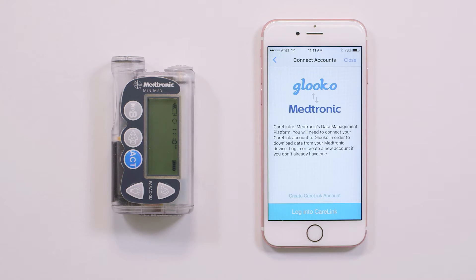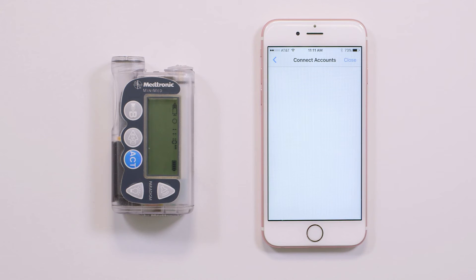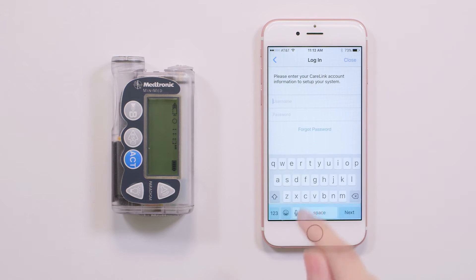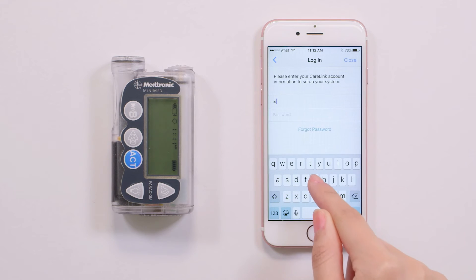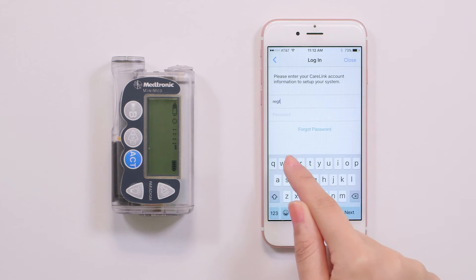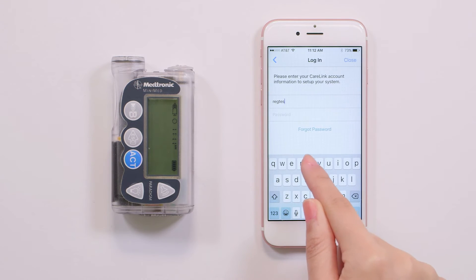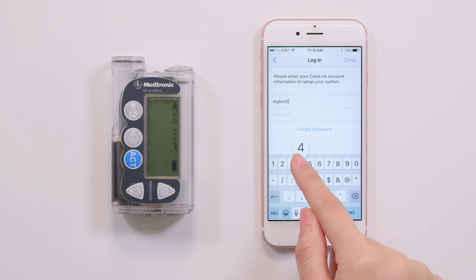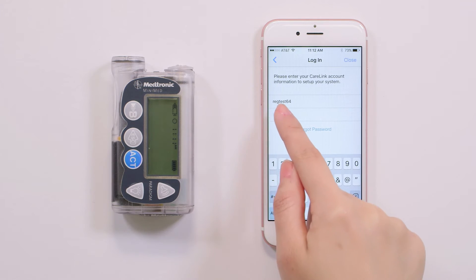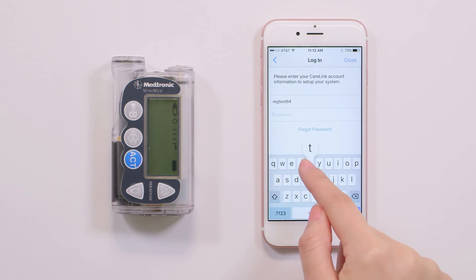Tap 'Login to CareLink' and enter your CareLink account username and password. By signing into your CareLink personal account, you are allowing Gluco to access and display your Medtronic data in the Gluco mobile and web apps.